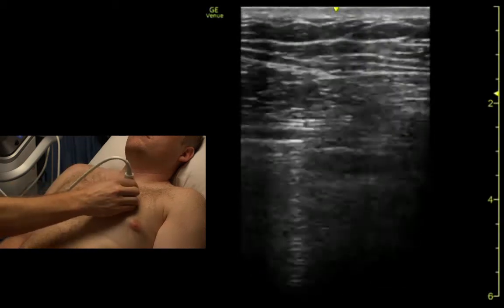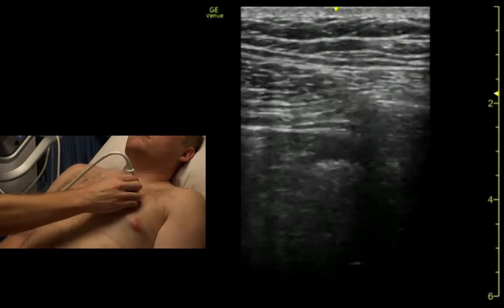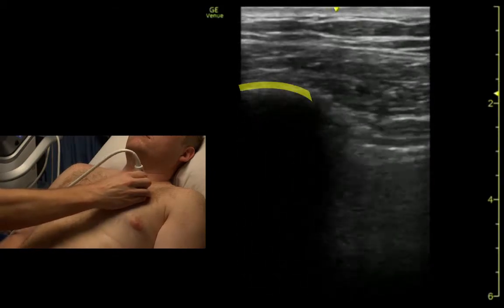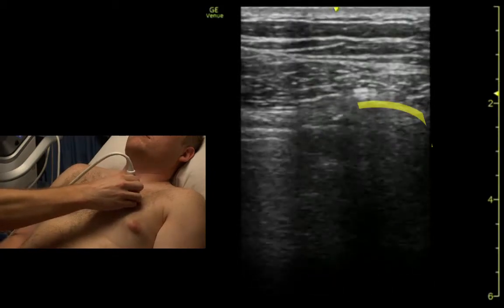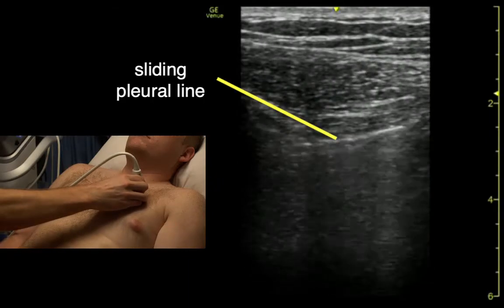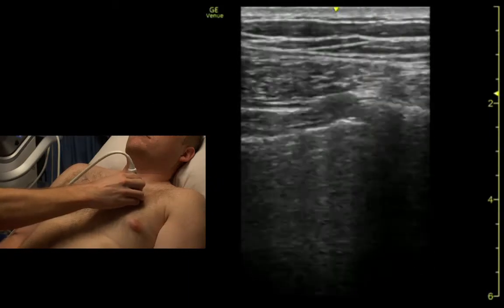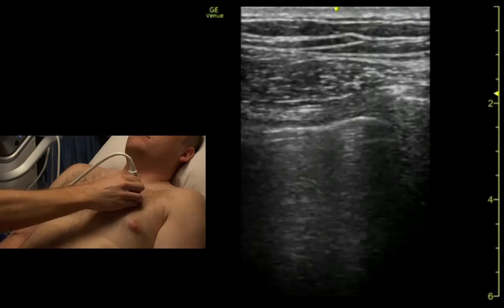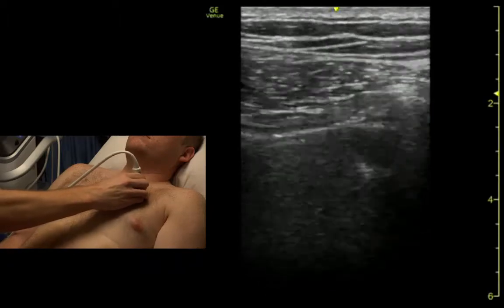So that would look the same over here — rib, rib, lung sliding. And we're actually starting to see the heart bump up against the chest there a little bit.